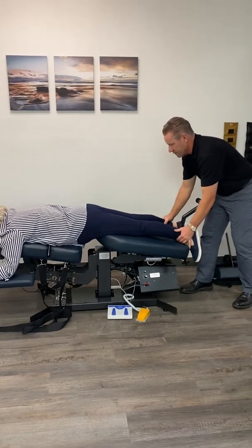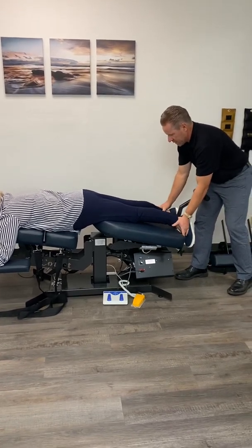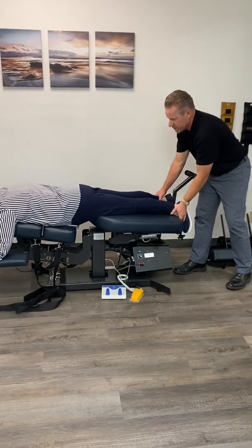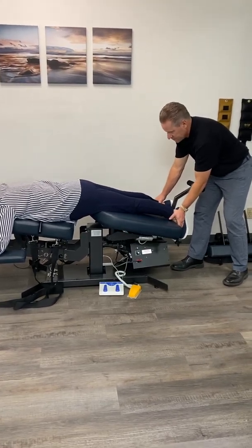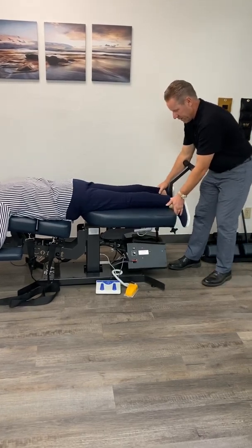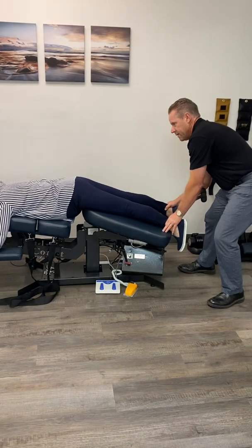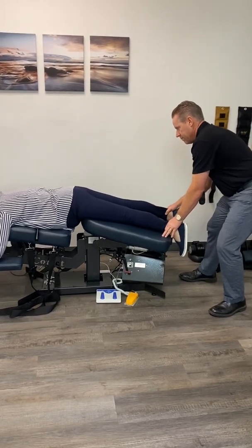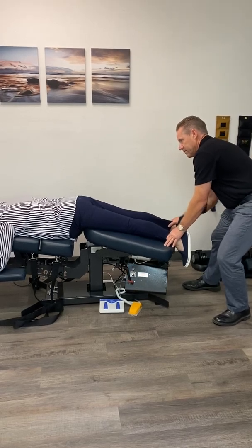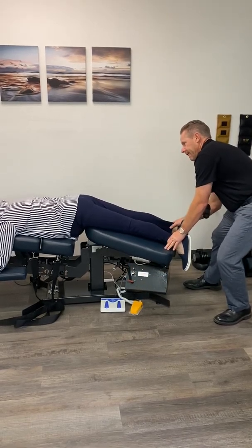And really, you're not strapped in there. So if I wanted to do this without straps, I would probably just hold you in this position a little bit. You just don't want this to come down on your thigh and hurt you. Now, if we wanted to go the other way, so now you feel that a little bit more on your right side. I do. Yeah.